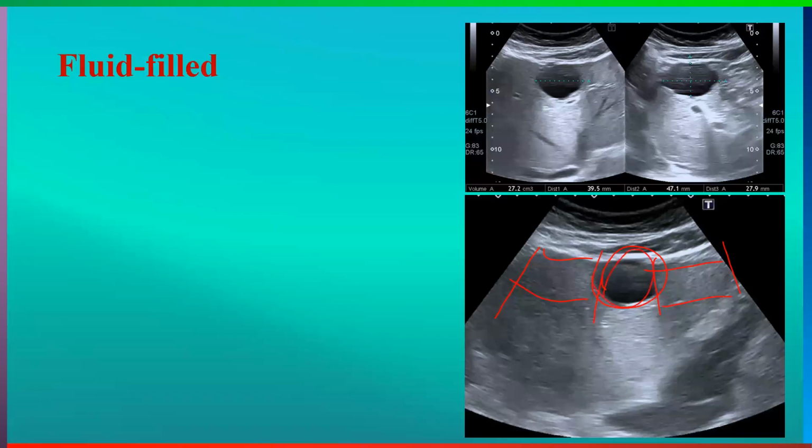That's why strong sound waves are coming to this region. This region is insonated by strong sound waves, and whenever echoes come back from this region, although the nature of the tissues at this region and this region are the same, these echoes are strong enough that they appear bright as compared to the adjacent tissues. That is due to the presence of this specific low attenuating structure at this region.